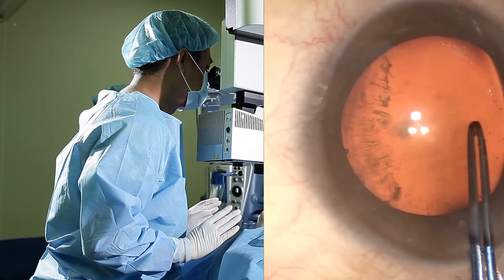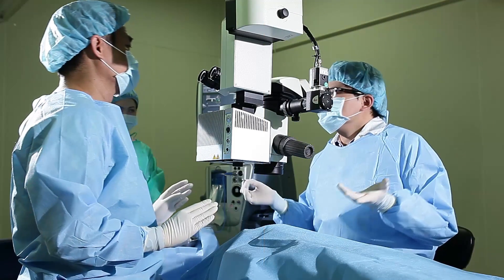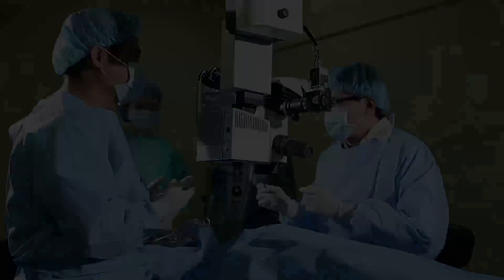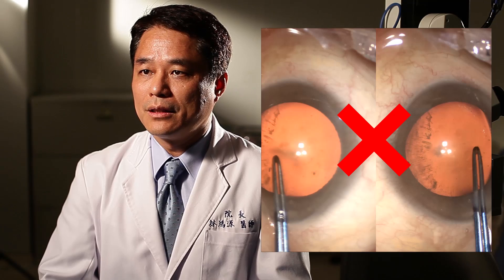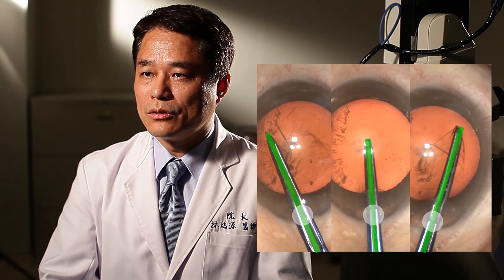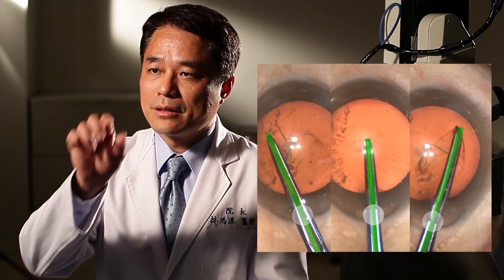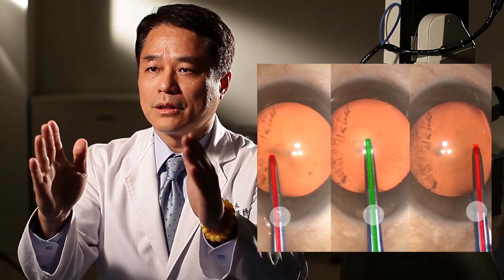The most common reaction of the young surgeon is: how come the human eye is so much different compared with in the lab? The most common mistake made by young surgeons is to perform cataract surgery by moving the instrument in a parallel direction instead of using the pivoting technique. This action can cause movement of the eye, extensive corneal deformation coupled with striae, and cause mechanical trauma.